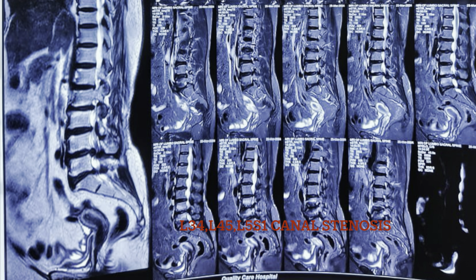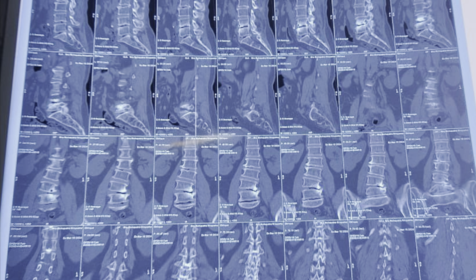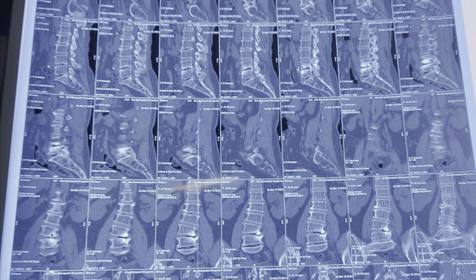Hi everyone, let's discuss a multilevel canal stenosis and its treatment by biportal endoscopic spine surgery. You can see L3-4, L4-5 and L5-S1 are completely stenosed with very narrow canal diameter. There is degenerative scoliosis at L4-5 level and severe stenosis at the other levels, that is L3-4 and L5-S1.